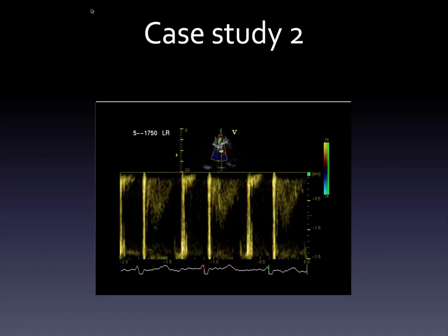Okay, so when you do a pulse wave Doppler onto this particular blue jet, you can see that this particular signal shows up. Is that normal to see that waveform in the left atrium with MR? No, that waveform would be far more characteristic of something either in the LVOT or in the aorta, some sort of arterial structure, with a peak velocity of almost 1 meter per second. Excellent. With the MR jet, it should be parabolic, like a U-shape, because it begins right away and only stops when the valve closes. And the jet velocity should be 4 or 5 meters per second in general. But this is weird, because when you pulse wave Doppler that particular blue jet, it only looks like something that would be in the LVOT.